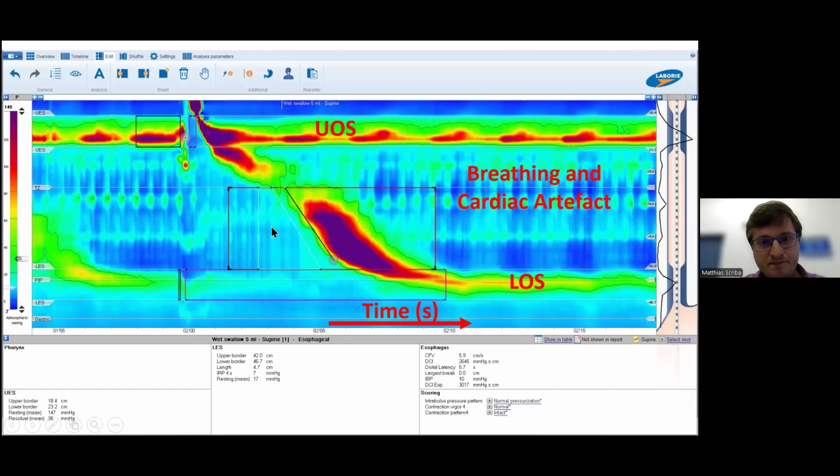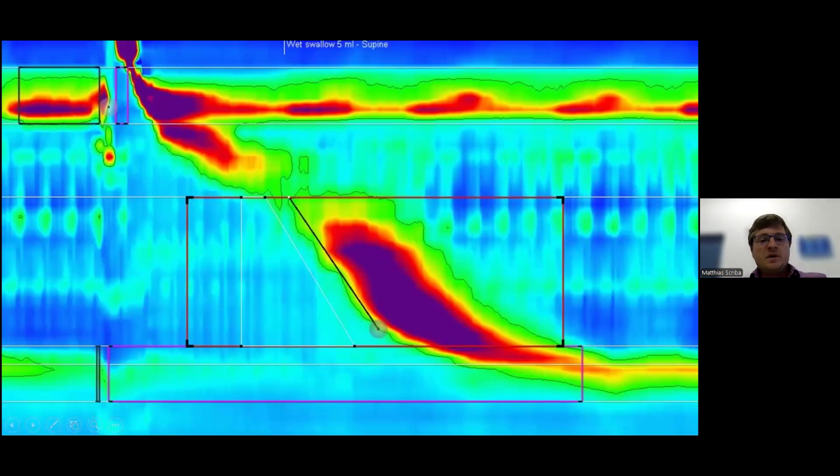It's artifactual. Okay, now when we look at the picture, we have to also understand certain metrics that we measure. So the machine automatically measures them, although we have to put the markers in the correct place. But there's basically 3 metrics that we have to measure, and this sometimes confuses people. So hopefully I can make it a bit more simple.